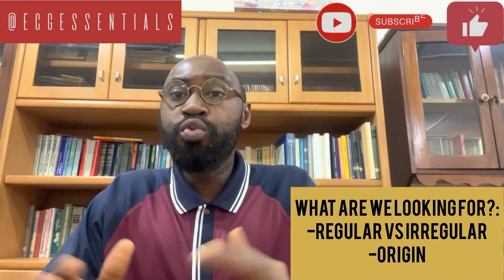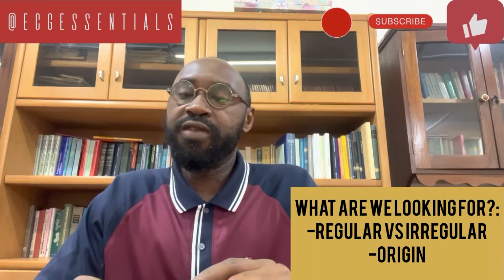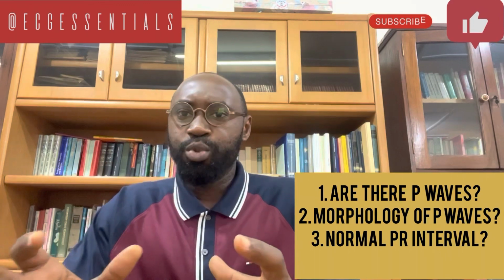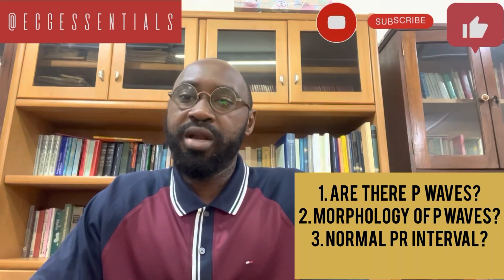And a few ways to be able to appreciate this origin will be to look at the P waves. So the first question is, are there P waves? If the P waves are present, then we have to look at the morphology of the P wave and the corresponding PR interval.